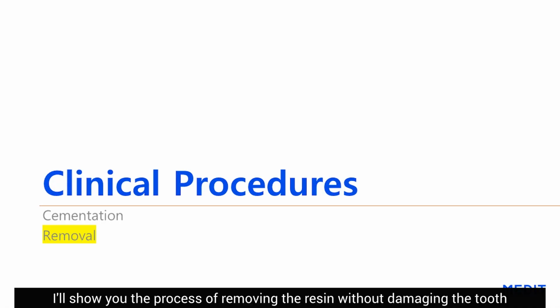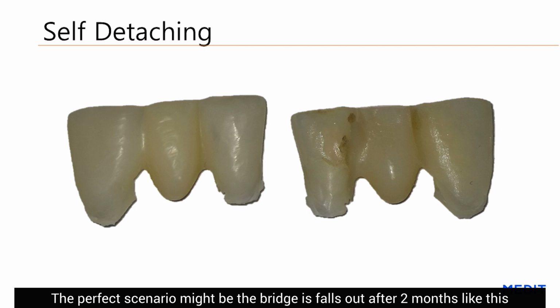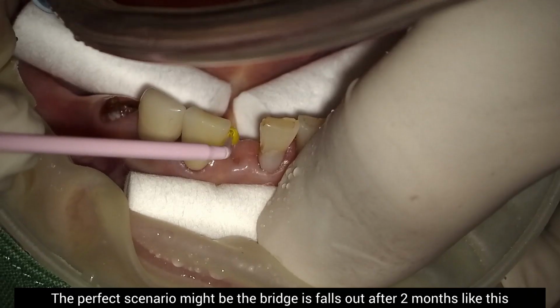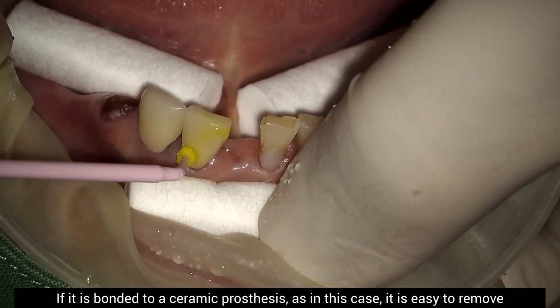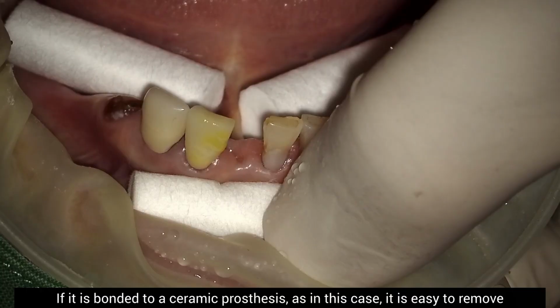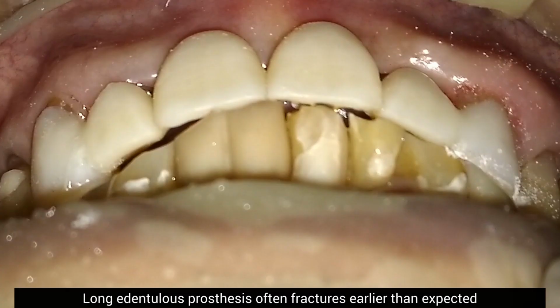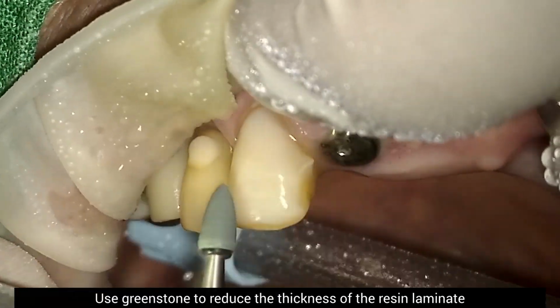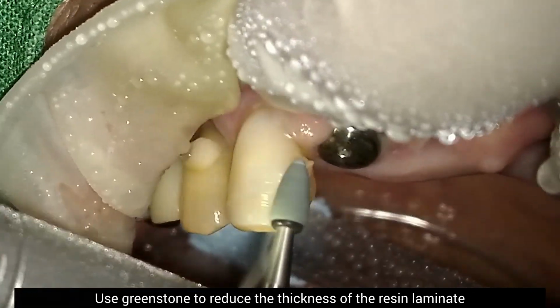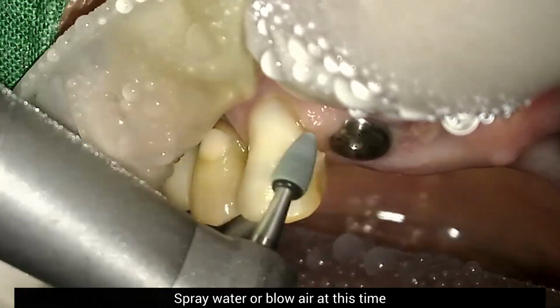I will show you the process of removing the resin without damaging the tooth. The perfect scenario might be the bridge falls out after 2 months like this. If it is bonded to a ceramic prosthesis, as in this case, it is easy to remove. Long edentulous prostheses often fracture earlier than expected. Use a green stone to reduce the thickness of the resin laminate. Spray water or blow air at this time.